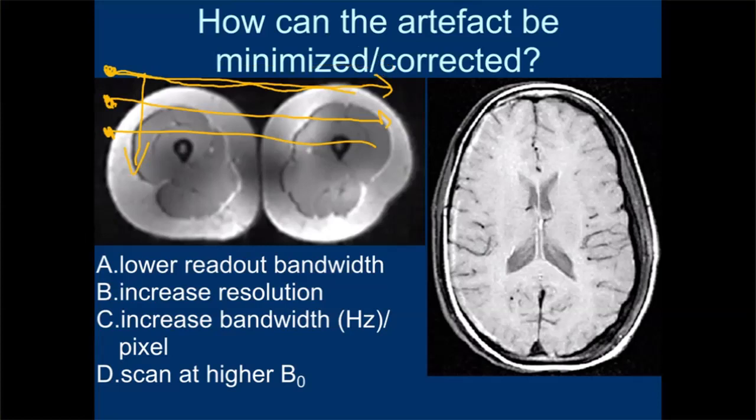As far as I remember, the chemical shift expresses itself as an exponential term, right? When we read K-space. Yes, a complex exponential term, which is phase pretty much. It's a phase component, and it increases along this direction. Because when you read, let's say, water, the phase of water, as you move in K-space, doesn't change. The phase of fat increases linearly because it's a different frequency.